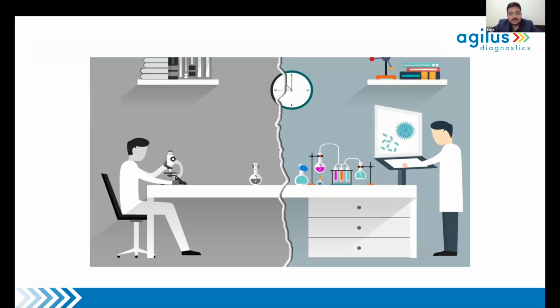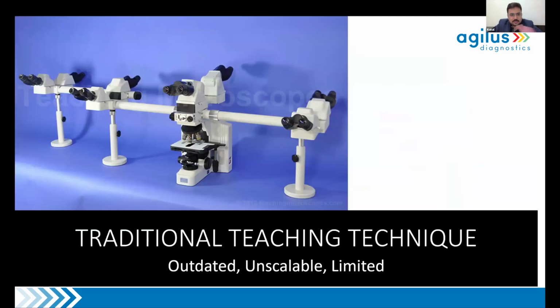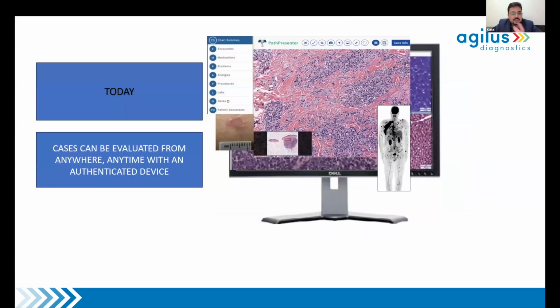Here you can see the difference between where we stand today and the yesteryears. This is how our traditional teaching technique used to be. We had a multi-scope at various institutes, and this is how it is today. We can have slides that we can view from anywhere in the world, any time with an authenticated device, and that gives us hundreds of scopes where people can view the same slide and even learn.